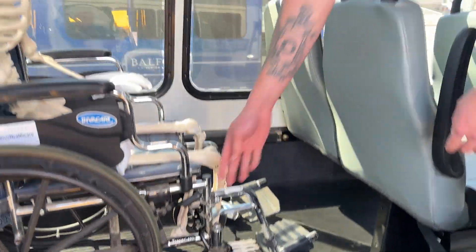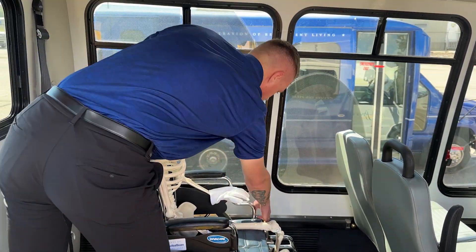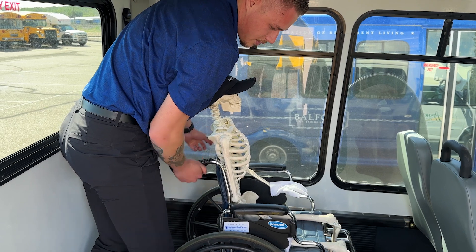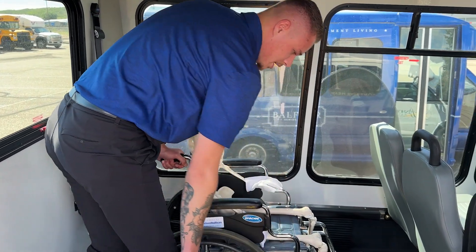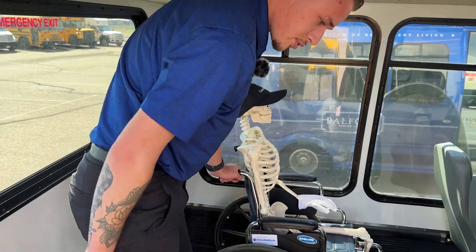We'll release the brakes on the passenger's wheelchair and make sure they're not moving around. Then reapply the brakes. You always want the passenger to make sure they're riding with the brake set still.